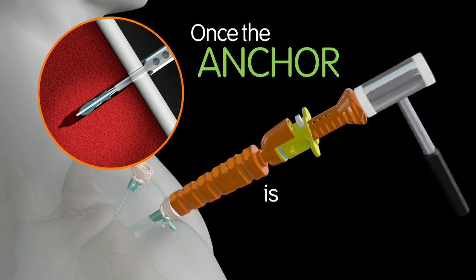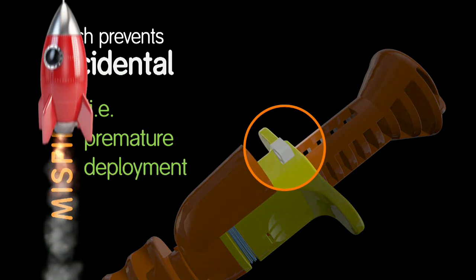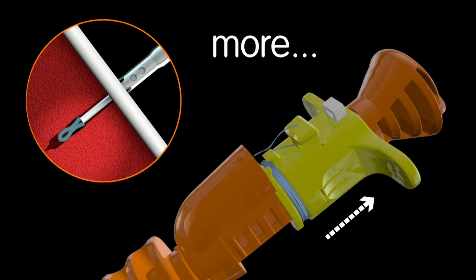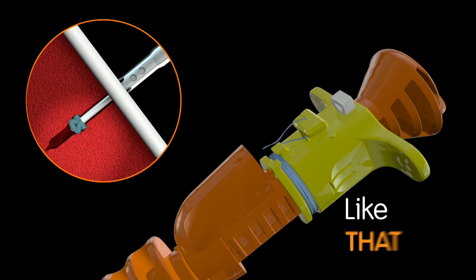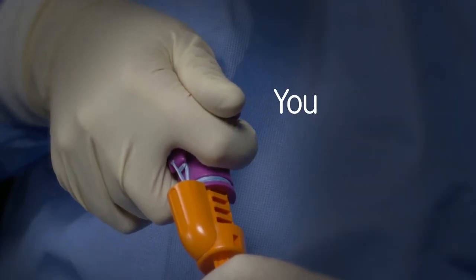Here's how. Once the anchor's in the pilot hole, you press the safety lock button, which prevents accidental misfires. Then just pull back on the trigger. More. More. Until it clicks. Like that. Click. You can hear it. Click. You can feel it.